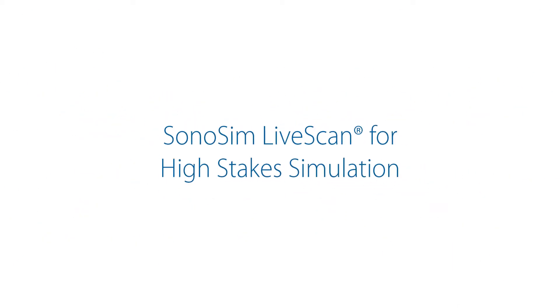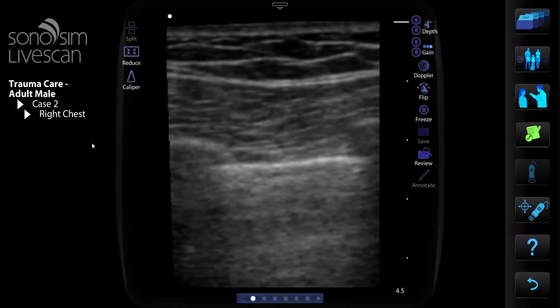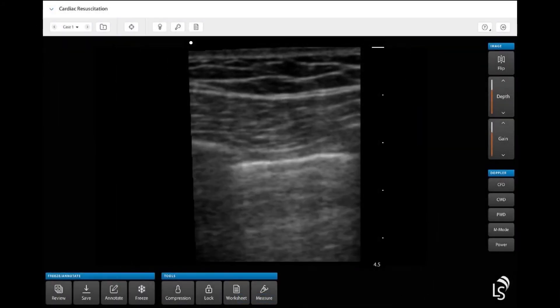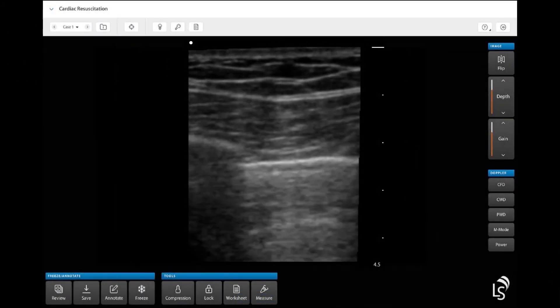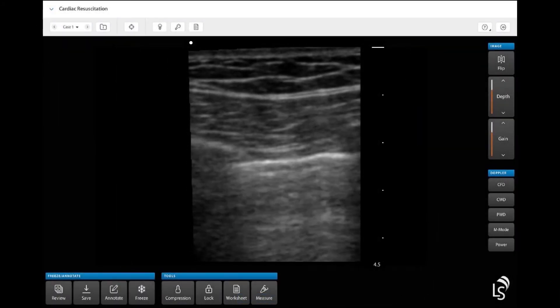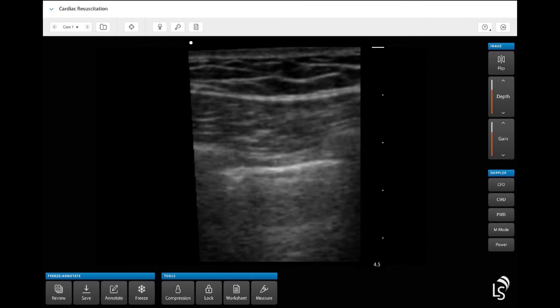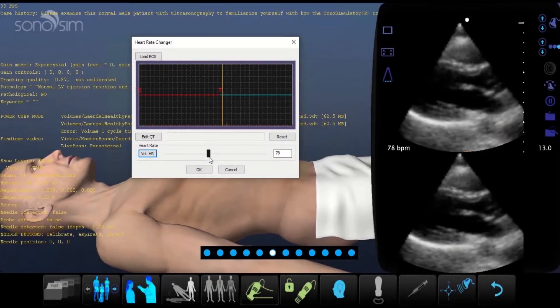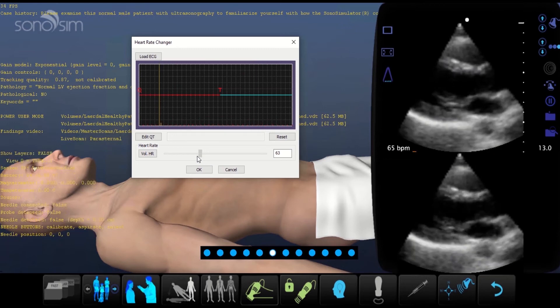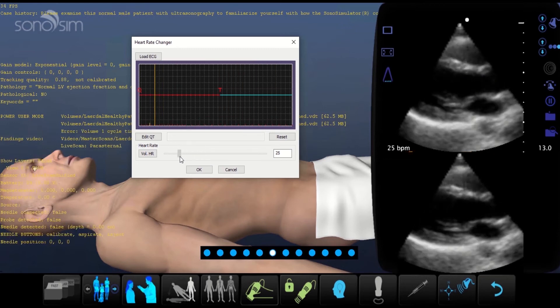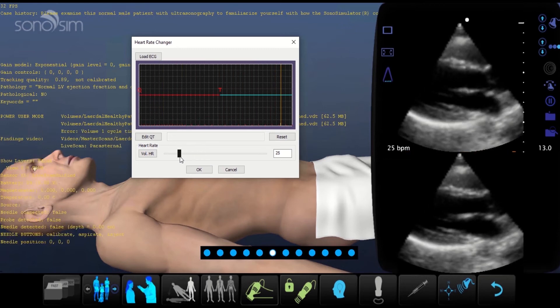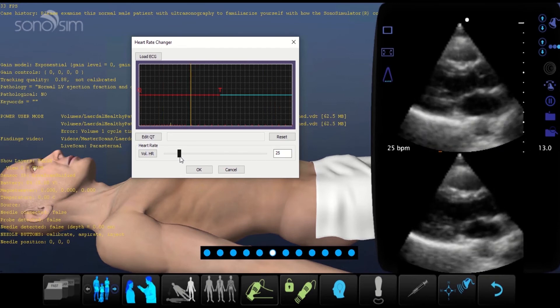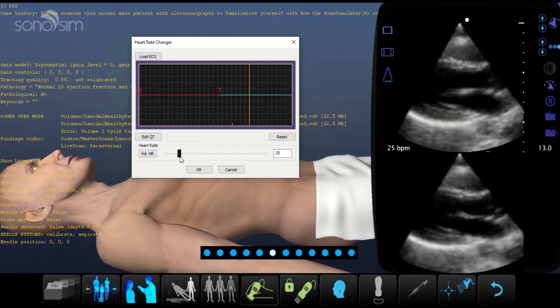To assist with running a remote or in-person simulation, the new interface in Sonosim LiveScan will allow for more realistic scenarios as you test medical decision-making with ultrasound. You will have greater flexibility in creating valuable simulation experiences, including being able to change the heart rate and respiratory rate of the patient as the scenario dictates.